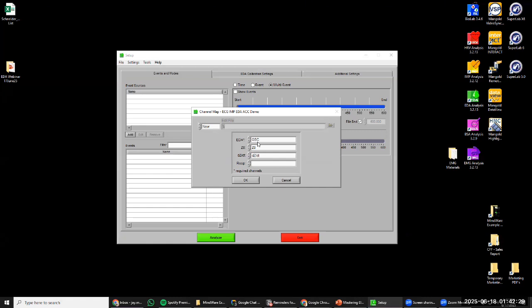took. So in this case, I have mapped the Z0 and DZDT. These are waveforms collected from impedance cardiography. Impedance cardiography has a benefit of also being able to extract respiration. So in this specific study, we didn't need to put a respiration belt on them because we can derive it from impedance. So anyways, that's what I've done across here. We do have a respiration channel. This would be only used if we had a respiration belt. So if we didn't have impedance, we could map that there.